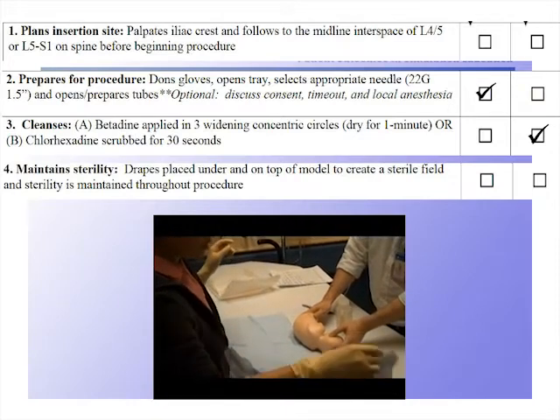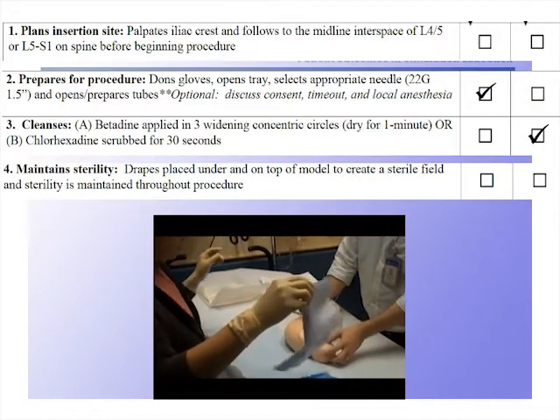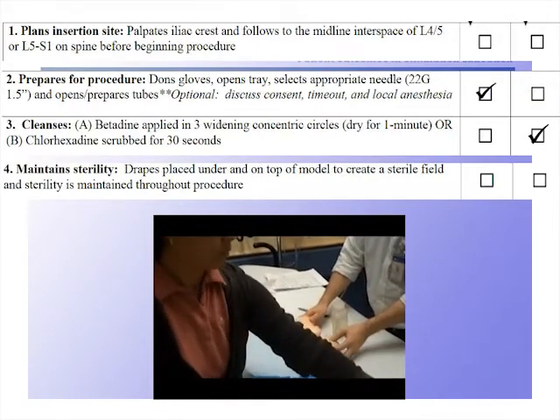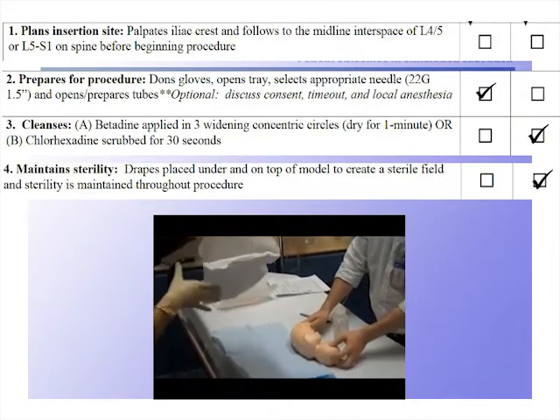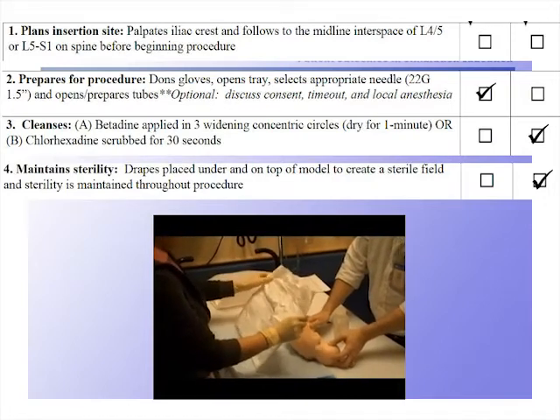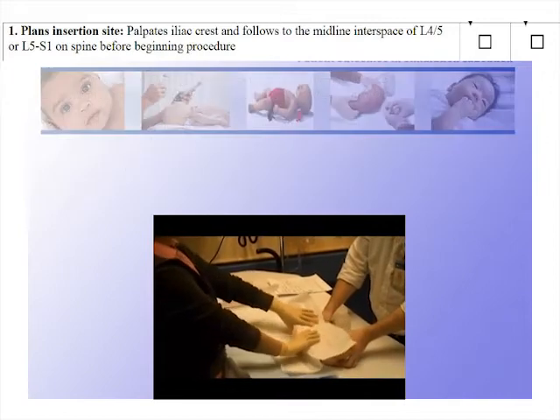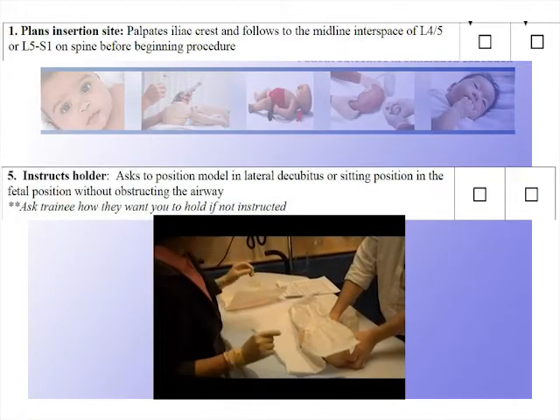Okay. And then this other blue sheet goes anywhere? You can set that one aside. Okay. That's an extra. There you go. Okay. Great. Now everything's sterile, and you can feel for your landmarks.